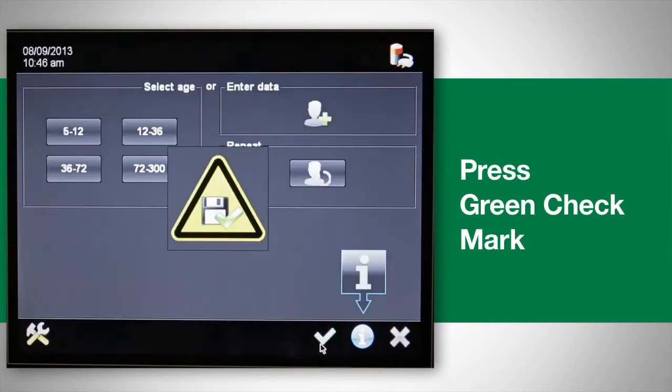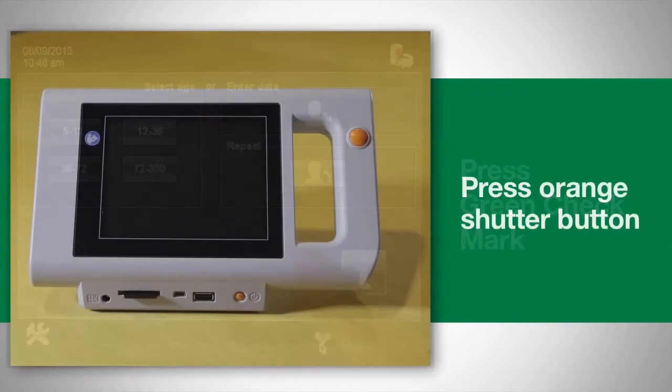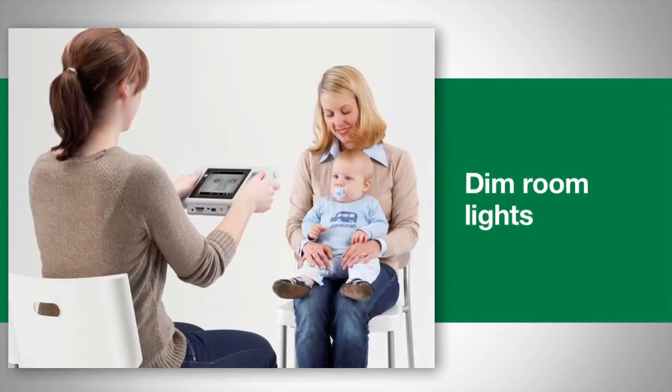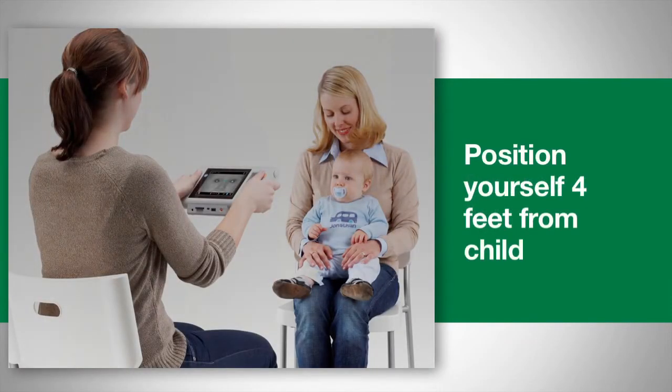Press the green check mark to save the child's information into the device, or you can simply press the orange shutter button to begin the screening. Before screening, dim the lights in the room and position yourself approximately four feet from the child.